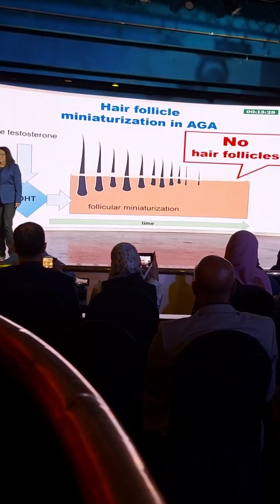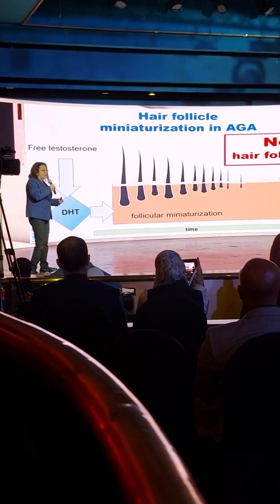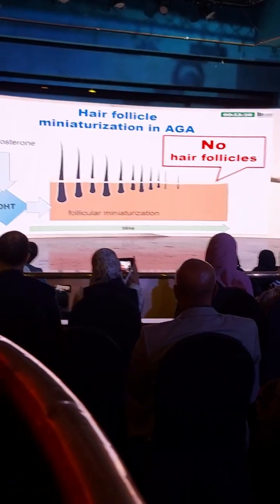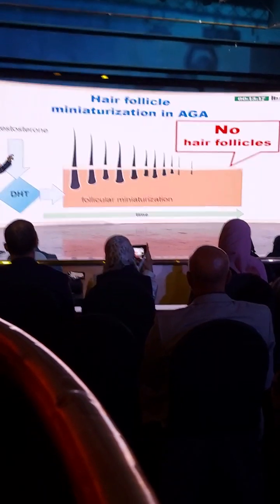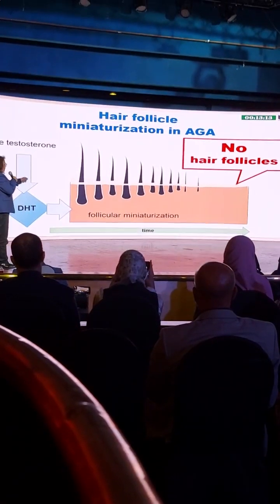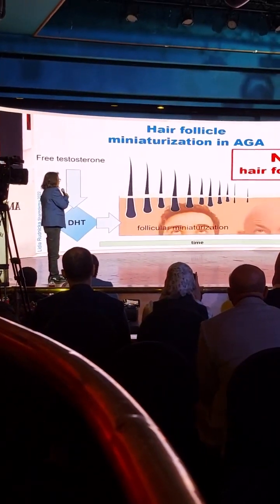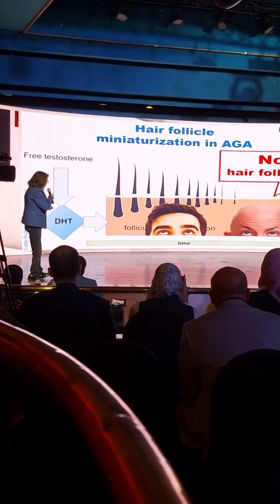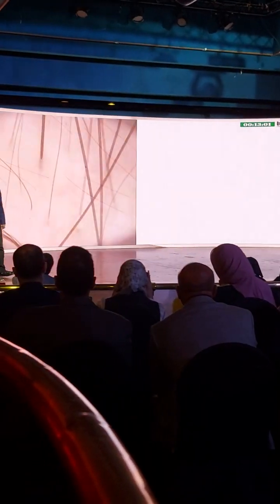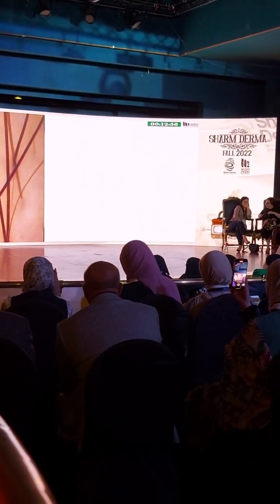And we have to keep this in mind if we have a patient who comes to our office with a long-lasting androgenic alopecia. Sometimes in trichoscopy it may even appear as cicatricial alopecia because we do not see any hair anymore, any hair follicle openings, and this may be a moment where the treatment will not be effective. So when we want to introduce treatment, the earlier we start, the better, and we should not be surprised if we see features similar to cicatricial alopecia in this patient.